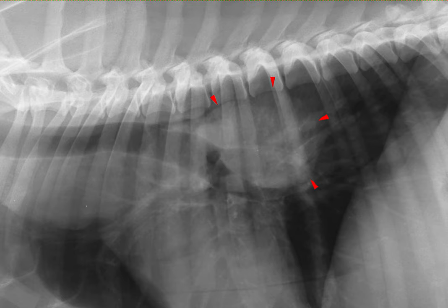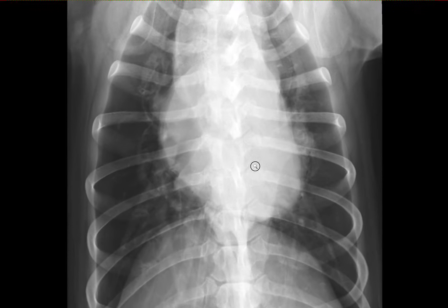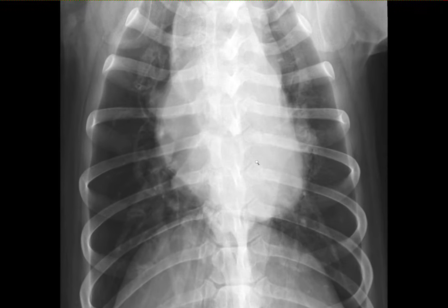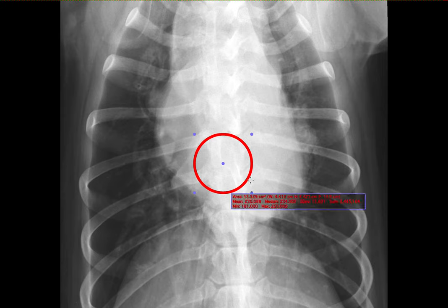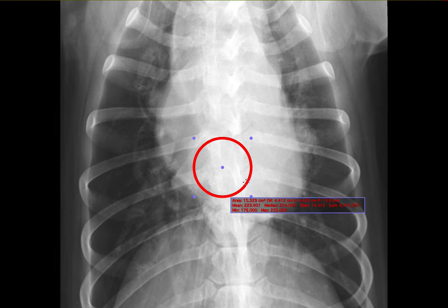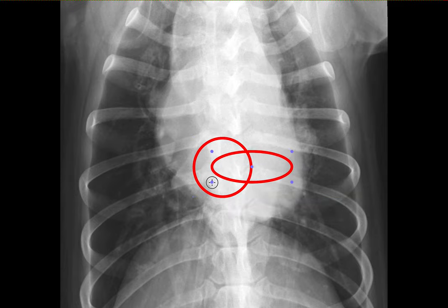Now, if you look at the dorsoventral view and try to identify the lesion, I cannot clearly see it, and the reason for that is because it is located somewhere here, which is superimposed on the heart. The fact that we don't see it on the dorsoventral view is further evidence that this is a mediastinal lesion. If this was a lung lesion, we would probably see it on one side or the other.